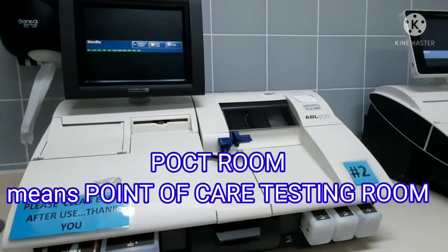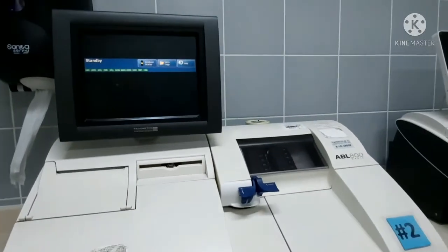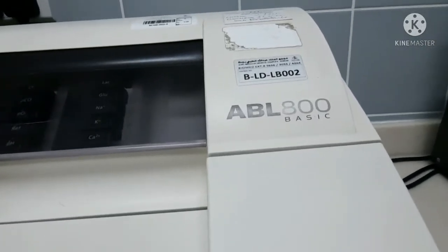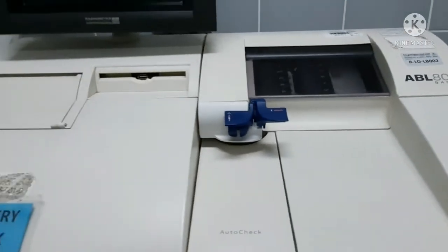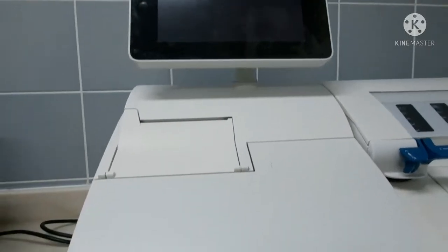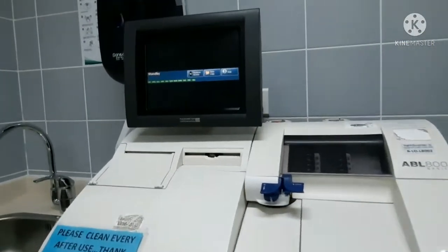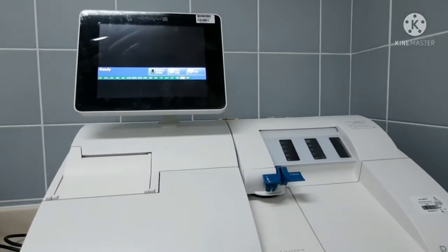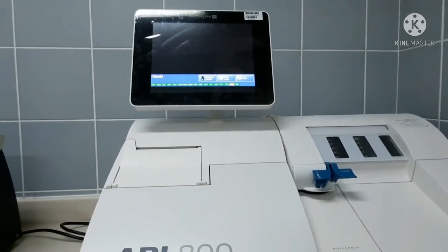We are here, guys, in our POCT room where our blood gas machine is located. This is our blood gas machine. It is ABL 800 basic. Blood gas machine is a machine that is used to determine the acid-base balance of the patient.